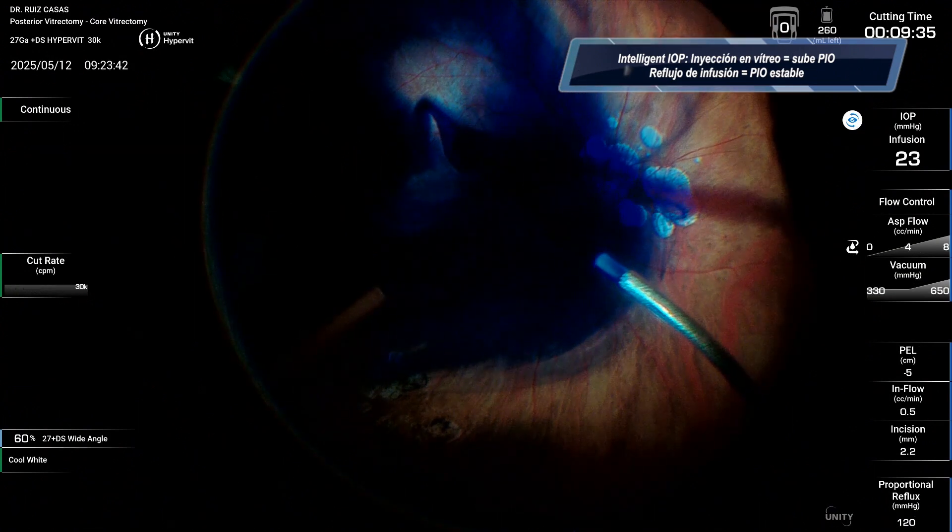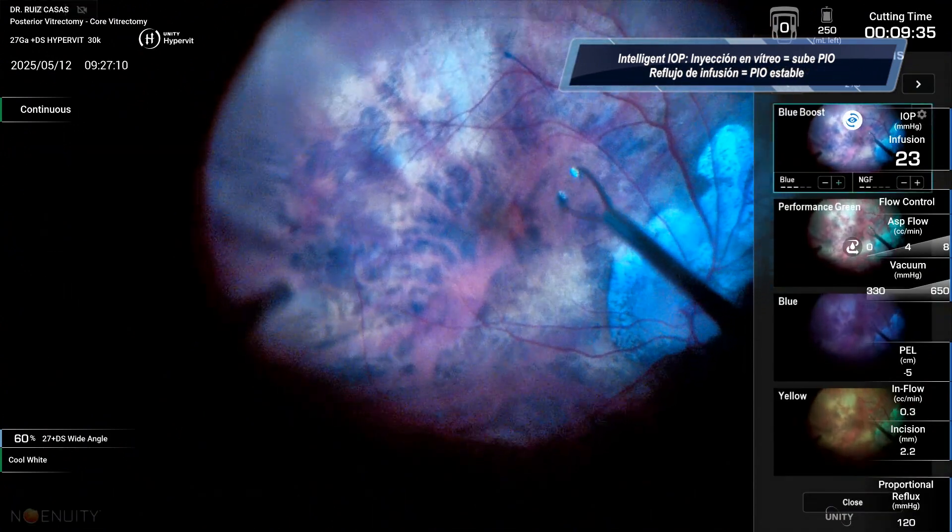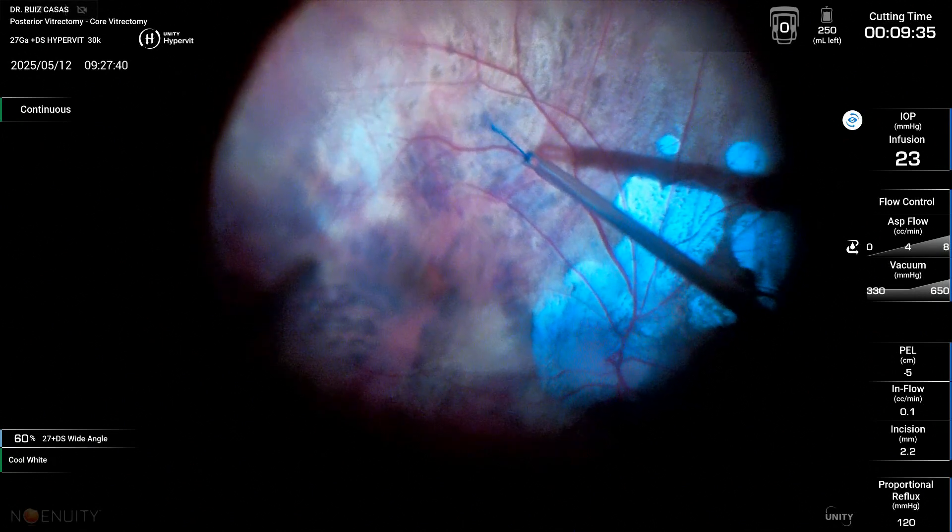Also, when you are doing your peripheral vitrectomy, this system allows you to know whether you are into the vitreous or not by the sound.